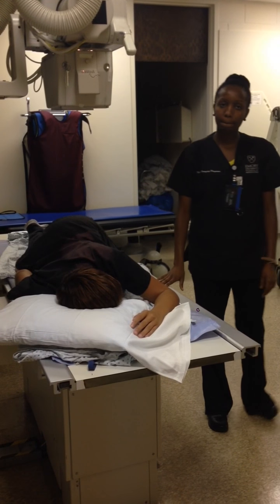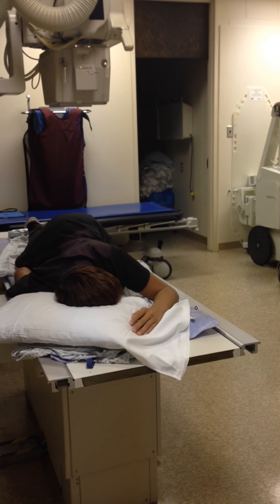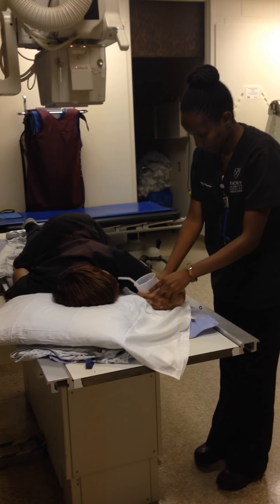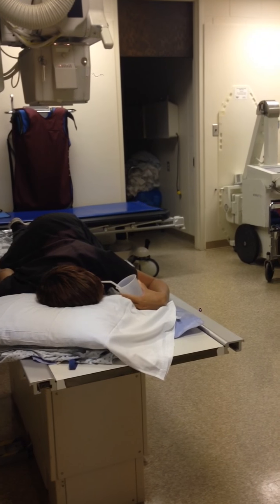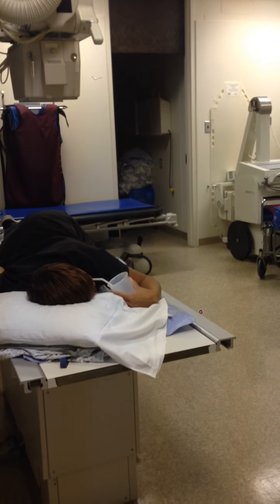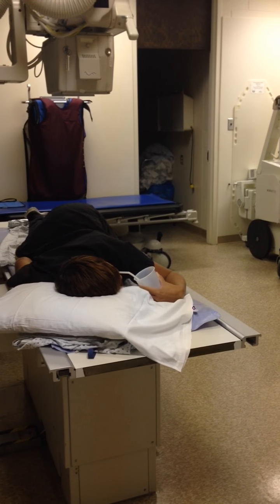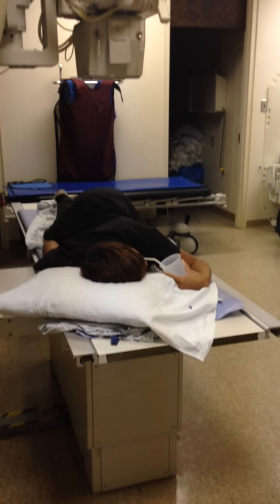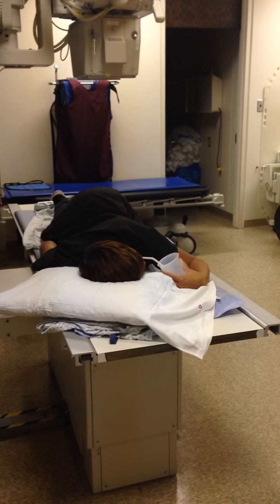Once everything is aligned, go through the instructions of the exam with the patient and make sure to give the patient the cup of barium with a straw to drink from. You will instruct the patient to swallow 2 mouthfuls of barium, and on the third mouthful, have the patient hold the barium in their mouth and instruct them to swallow while simultaneously taking the exposure. Take your first sip, another one, hold the next one, now swallow, exposure.